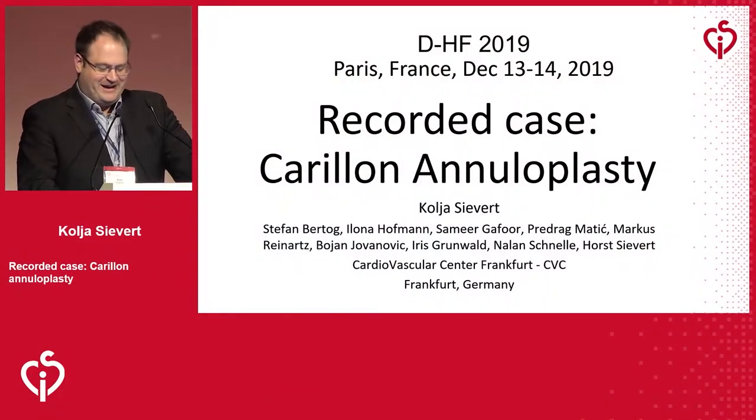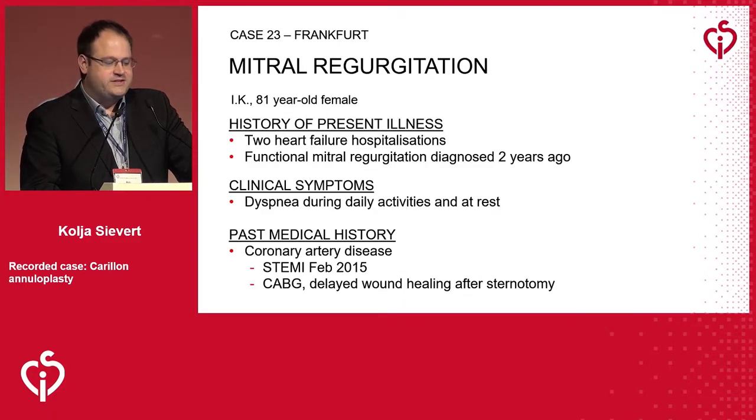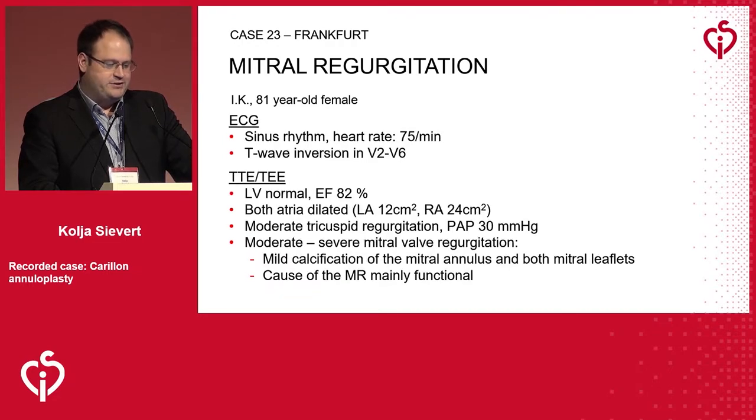Oh, okay. So I want to show one case for the Carillon annuloplasty. This is an 81-year-old female patient. She had two heart failure hospitalizations prior, and functional mitral regurgitation was diagnosed 2 years ago. The patient had dyspnea during daily activity, but also at rest. And regarding past medical history, the patient had a STEMI in February of 2015, which was treated by CABG.